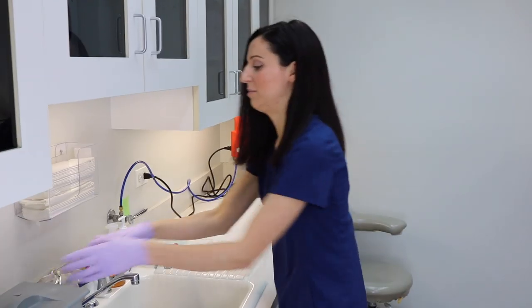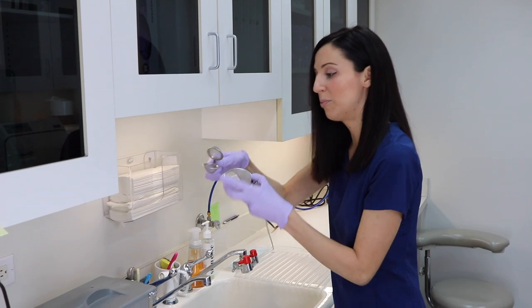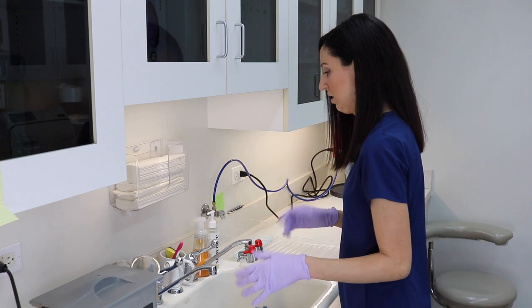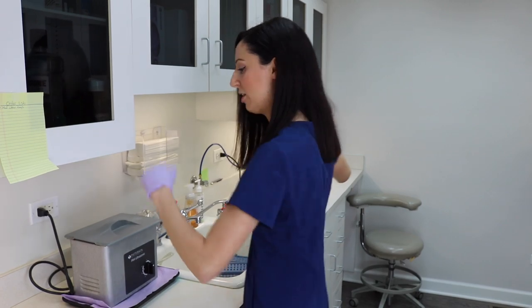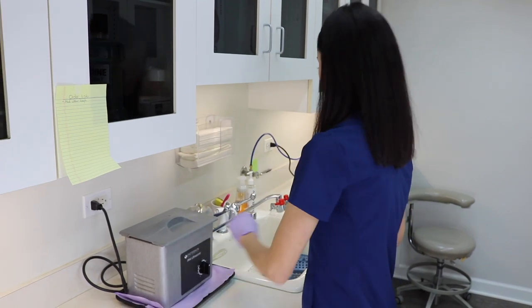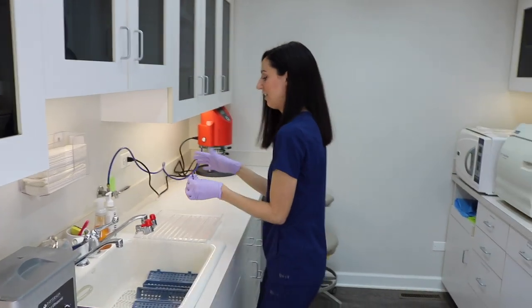We have these little holders for burs and stuff. A hygienist might put their ultrasonic tips in here depending on what the manufacturer says. We also have a special implant attachment for the ultrasonic. Let me grab an instrument to show you the process — you put it in, it runs, and when it's done you bring it over here.